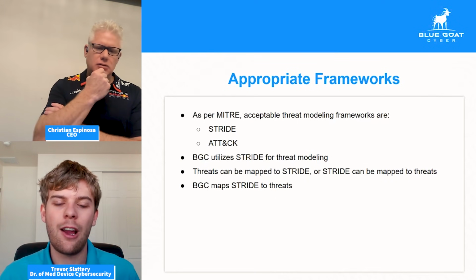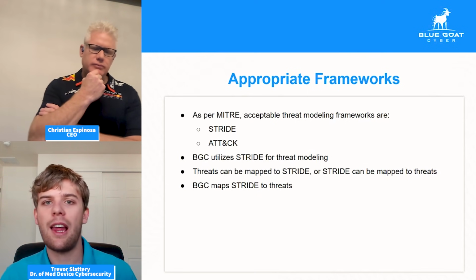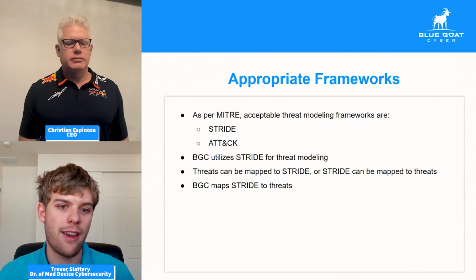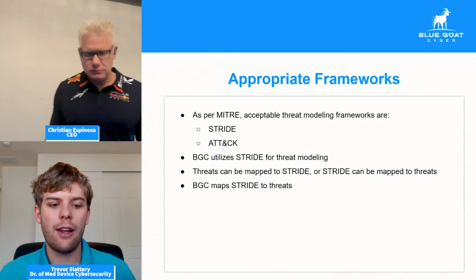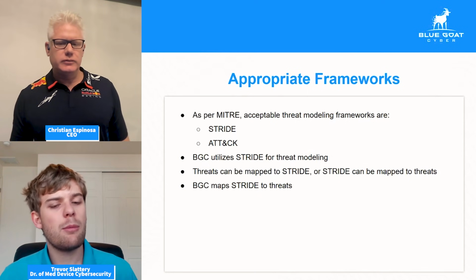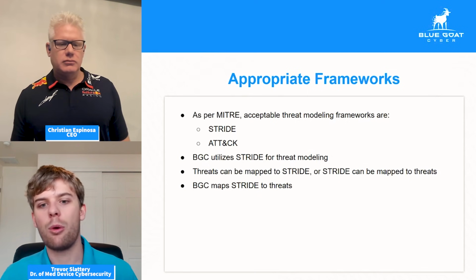All right. There are a couple of frameworks here. So as per MITRE's guidance, the acceptable threat modeling frameworks that we like to see in most cases for medical devices are STRIDE and MITRE ATT&CK. We typically use STRIDE for threat modeling, though this can vary. Threats can be mapped to STRIDE, or STRIDE can be mapped to threats. And it's an important distinction.